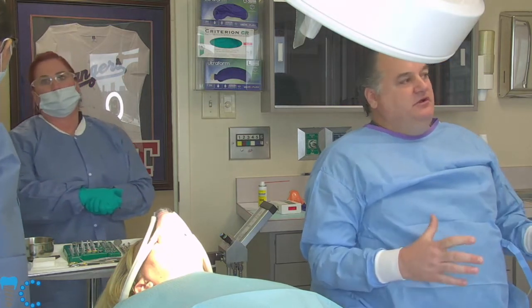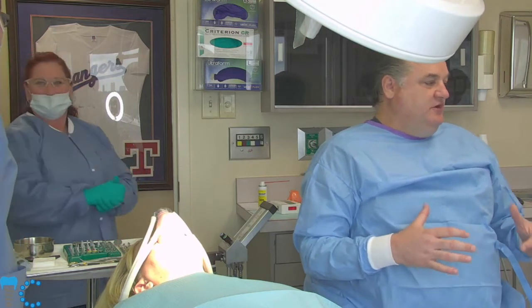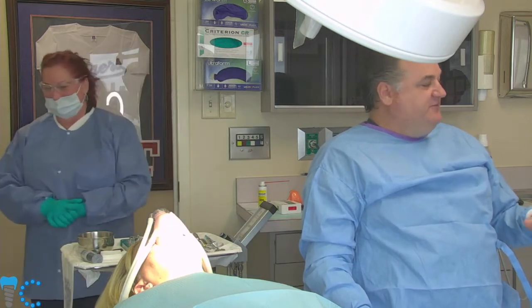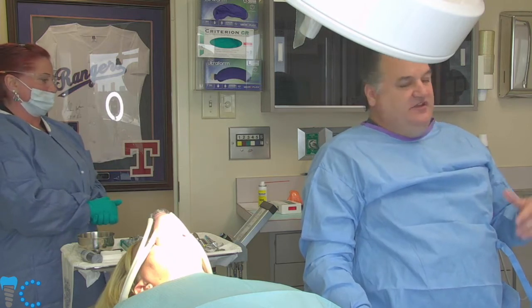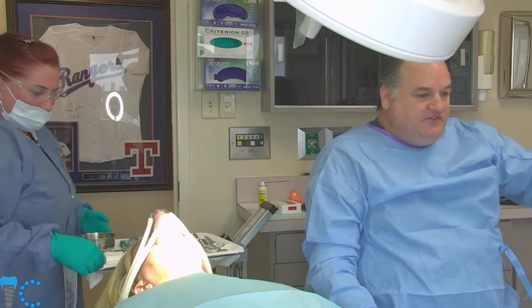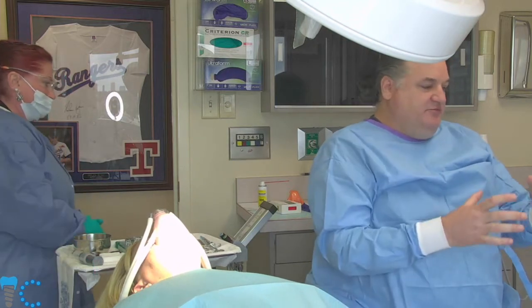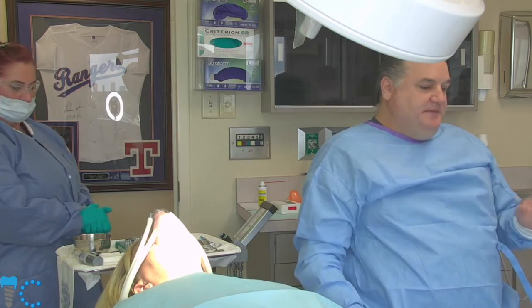These are parallel-walled implants or cylindrical implants. They're designed to be placed under a low torque. And by that I mean a maximum of 30 Newton centimeters. I would say 35 Newton centimeters is the absolute upper limit. So that's not the ideal torque placement, that's the upper limit. So if you placed an implant and it didn't get higher than 15 Newton centimeters of torque as you're placing it until the shoulder seats, there's no problem with that. As long as our implant's not loose in there, has no lateral mobility to it, then we're good.